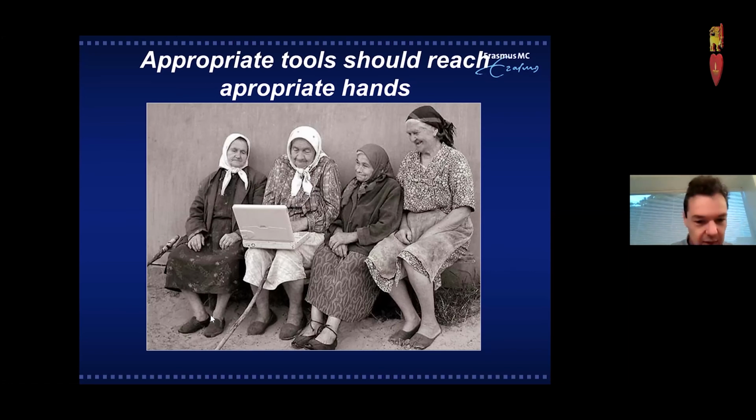So you mentioned three things which I did capture from your case: a lot of tapering and somewhat ostial disease, and a dominant circumflex. That's also an important one. One or two millimeters of disease, the experience there is that it's not relevant. Five millimeters is what people keep as cutoff value.